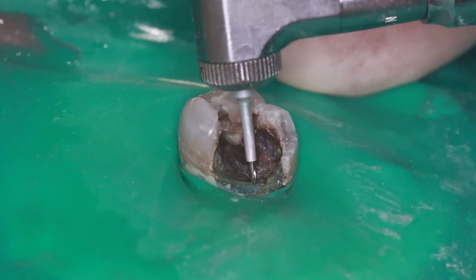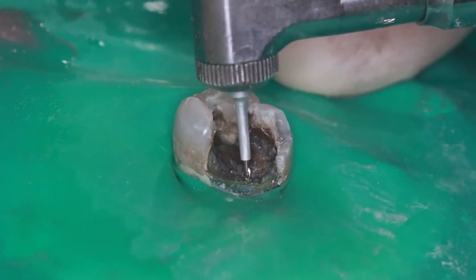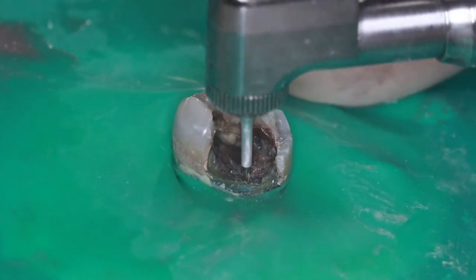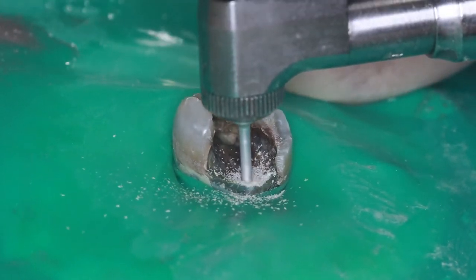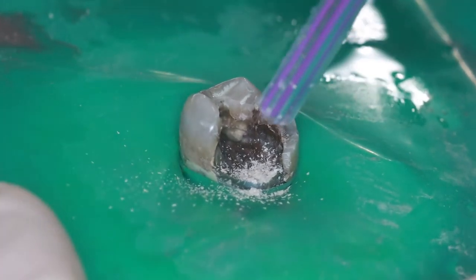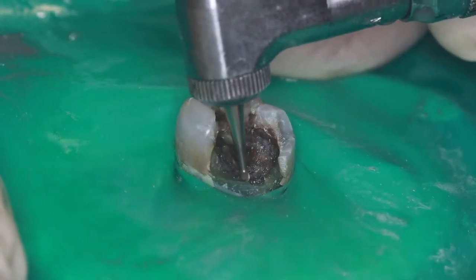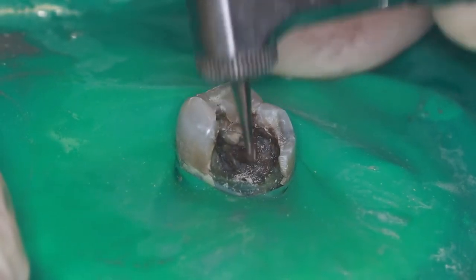When drilling the hole for the pin, I have to pay attention to where I'm drilling and the angle of the drill. I don't want to place the hole too close to the center of the tooth since I might drill into the nerve space, which could lead to a root canal. I also don't want to place the hole too close to the side of the tooth, as that could shear off part of the tooth, leaving a bigger problem to repair. So I find a spot in the middle and place the pilot hole first.